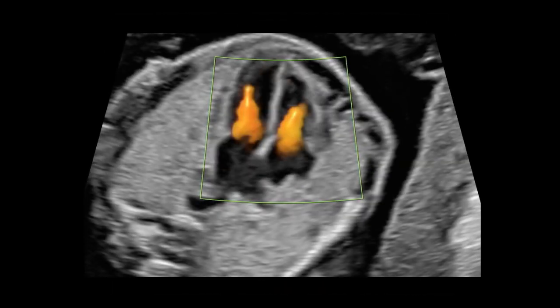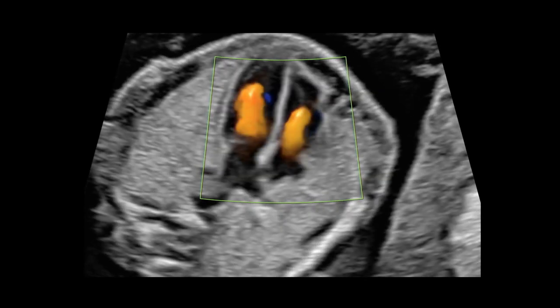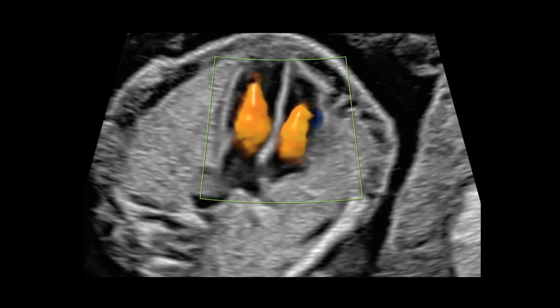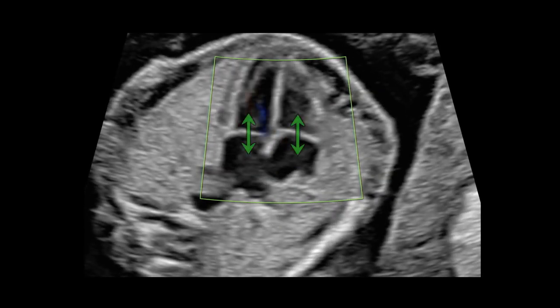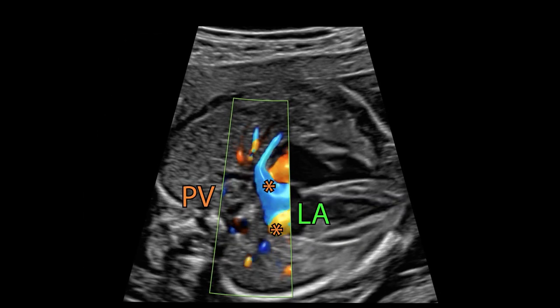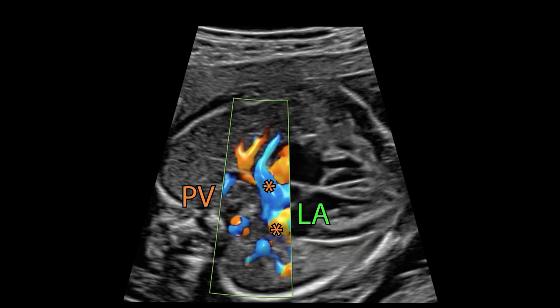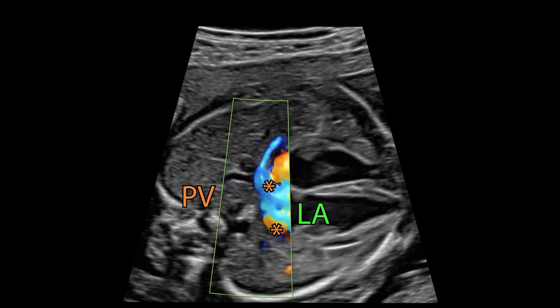Additional color Doppler allows the assessment of the atrioventricular valves and shows absence of regurgitation. It also helps confirmation of the pulmonary venous drainage to the left atrium.